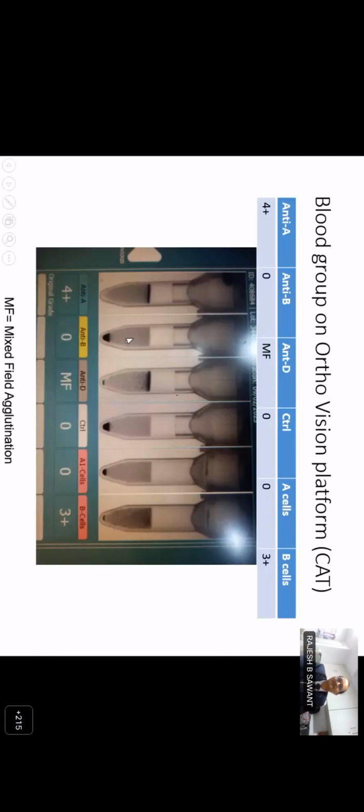Previous sensitization won't be a possibility. Absolutely. Right. There is no relevant clinical history also. So we just expect that this will be a clear-cut blood grouping that we will be reporting. So let us see what happens further in this case. We have the ABO grouping results over here. What can you see? ABO and Rh grouping.